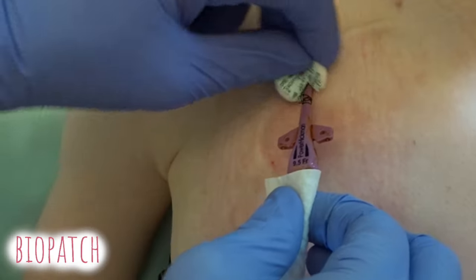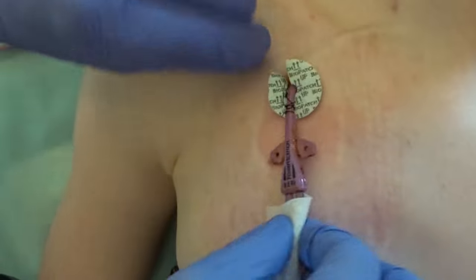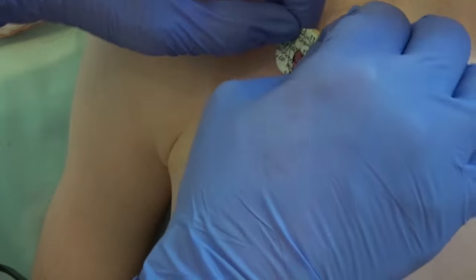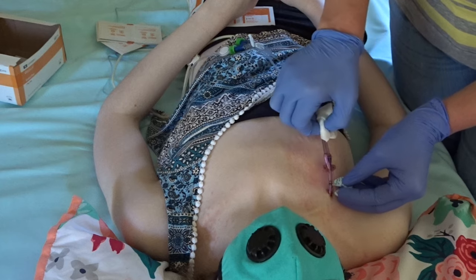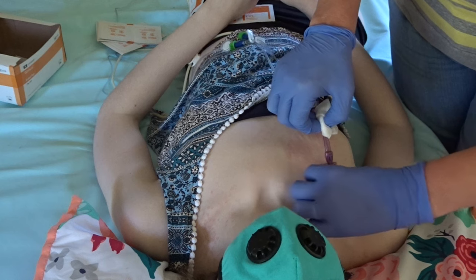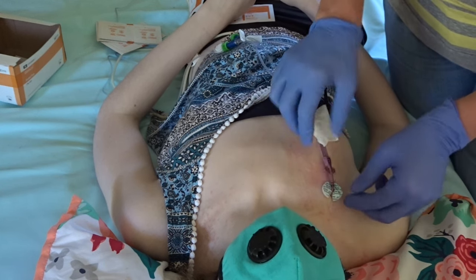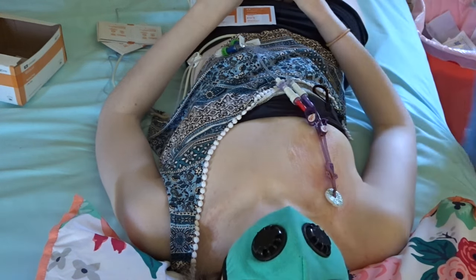Give the skin a few seconds to dry before proceeding with the dressing change. If applying a bio patch, take it from the sterile field. The bio patch is not to be thrown on like a pickle on a sandwich — it has a hole and a slit for a reason. It goes around and under the line. You may have to use sterile gauze again to move the line to do this, but do not reuse the same piece of gauze.